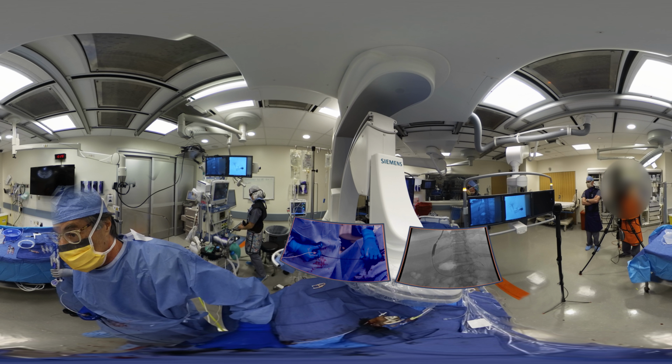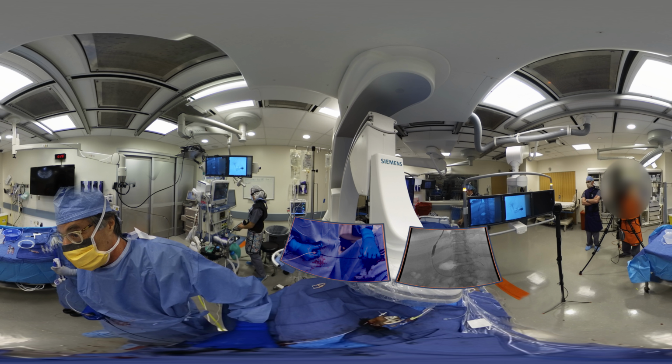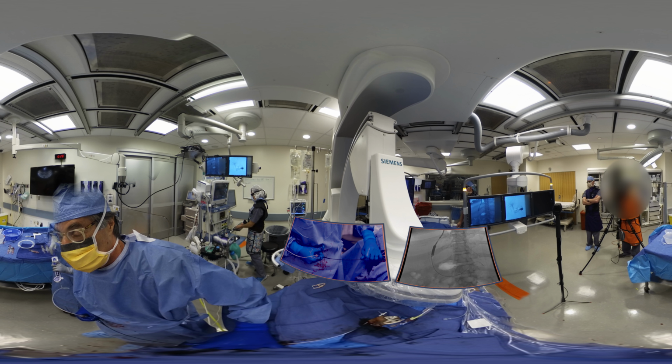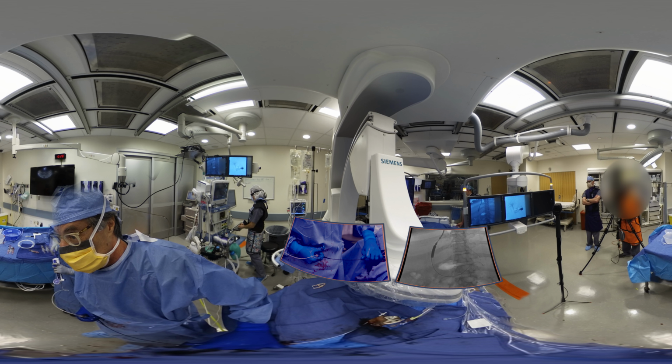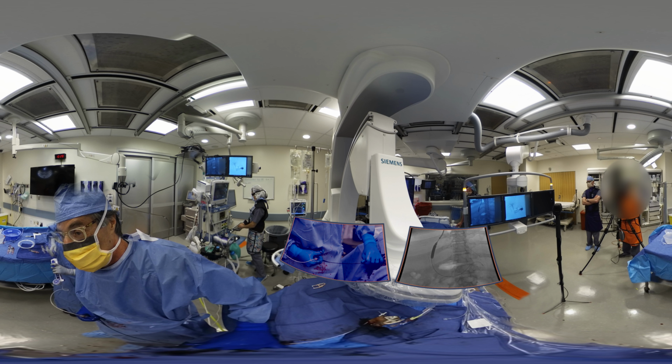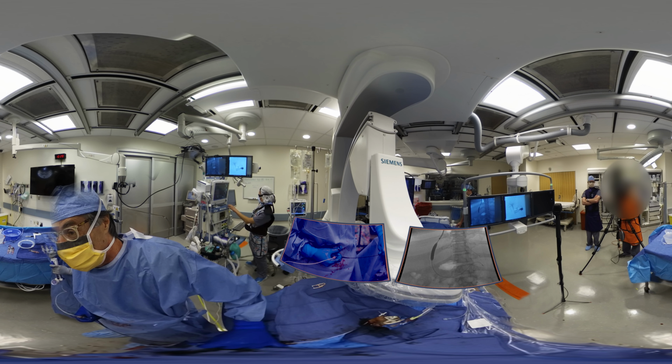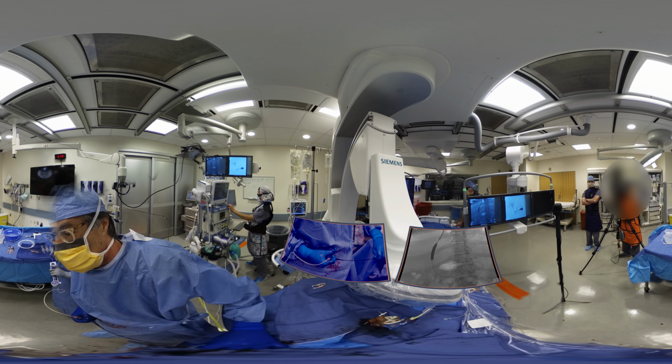Even before complete deflation, I'm going to start to pull it back because we'll see the impression of the balloon. So let's reinflate there. Okay, we'll make that impression disappear. Show it who's boss. And holding. All right, deflate, 16 atmospheres.